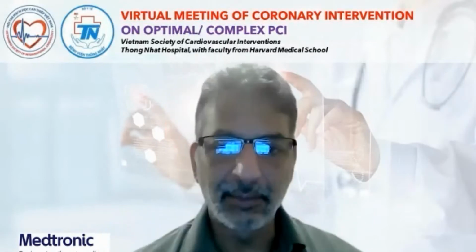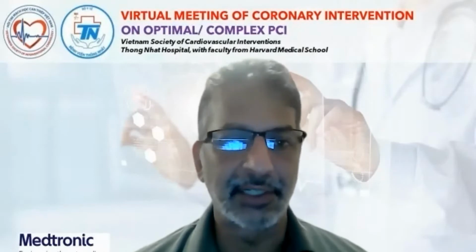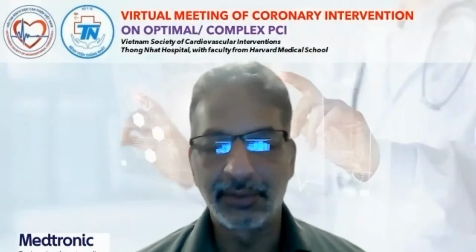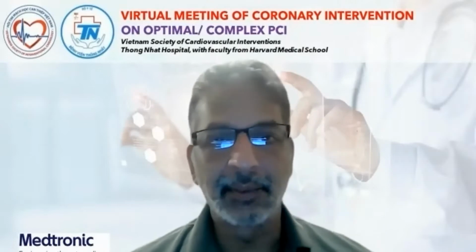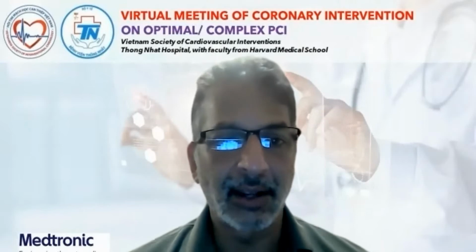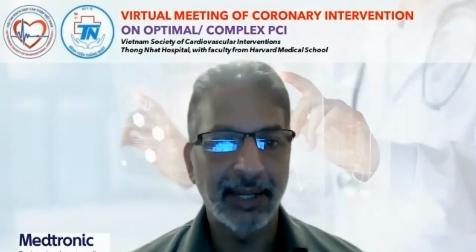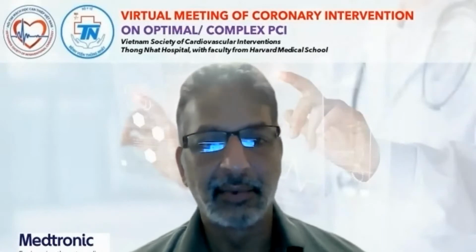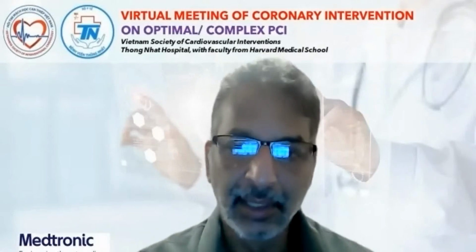Yeah, it's a really important question. I think it is a question with a lot of controversy, and we don't know the truth. We have a luxurious situation in the United States that we can use it if we deem necessary. I'm interested in the ongoing trial PROTECT IV that's randomizing patients with very complex disease and reduced ejection fraction to Impella versus either nothing or a balloon pump.